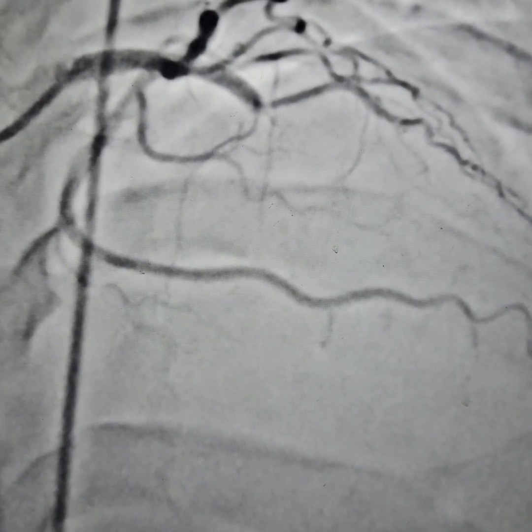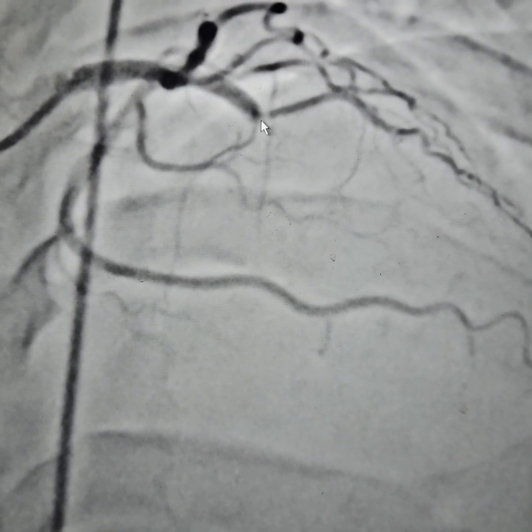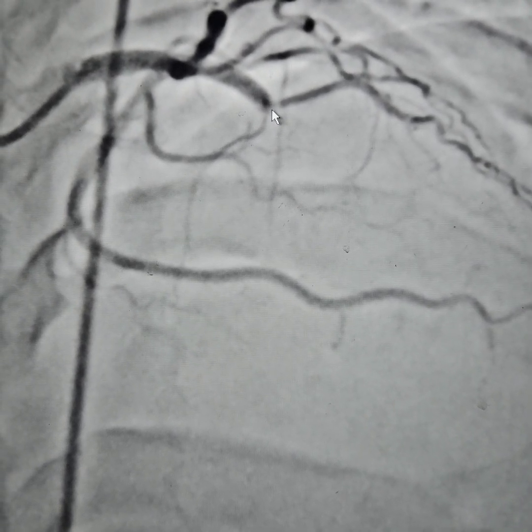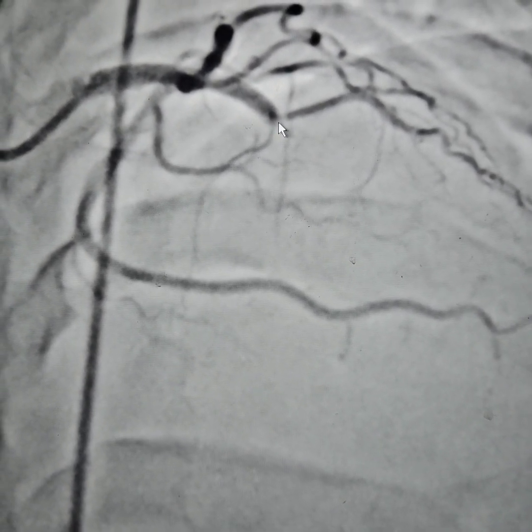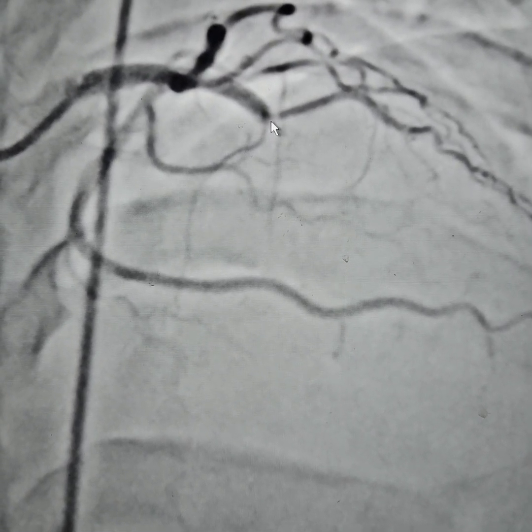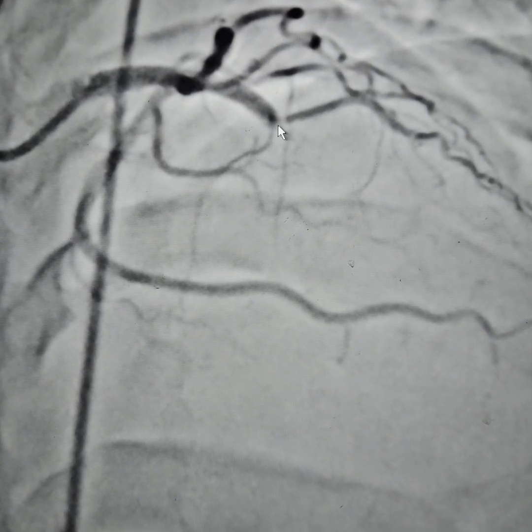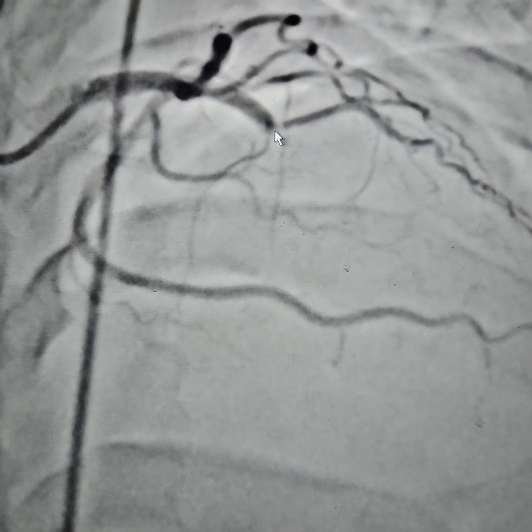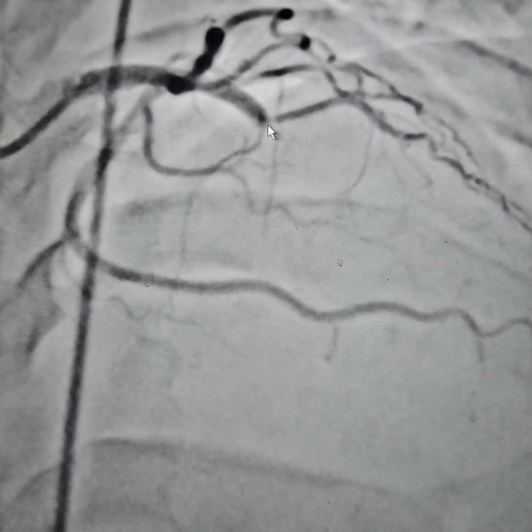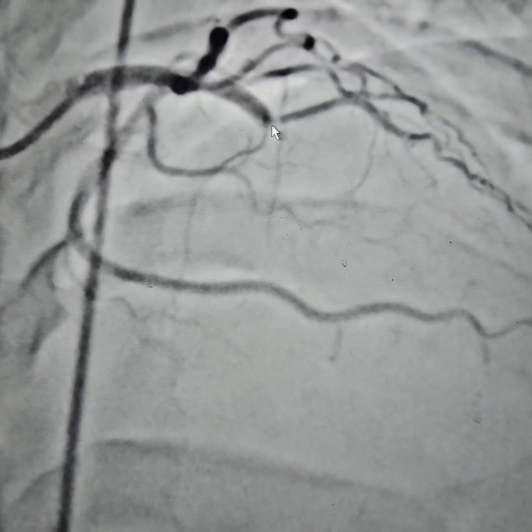This was the case of extensive anterior wall MI. You can see that the LAD is blocked 100% right here. I would like to stress that the patient did not have chest pain, but instead had a history of palpitations, fatigue, and shortness of breath since the past 15 days, which was sudden in onset. The pain, even if present, was very mild and occurred about 15 to 18 days back as per his recollection.